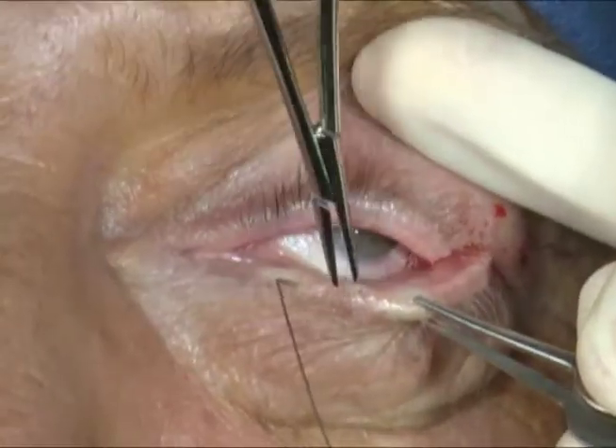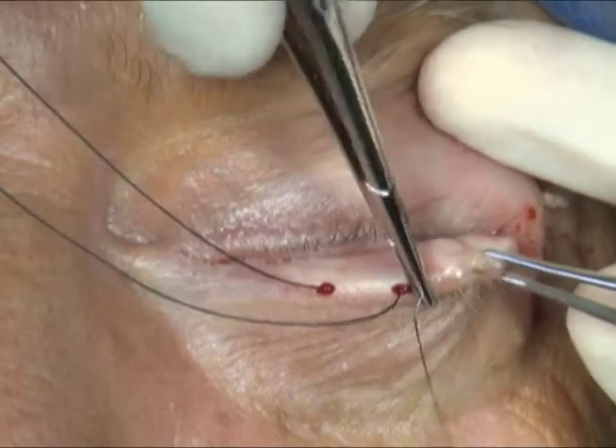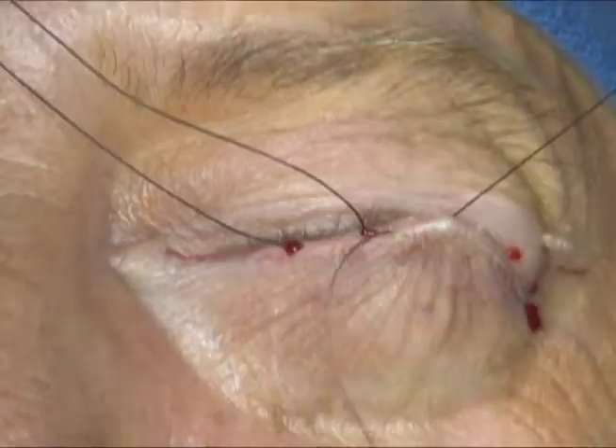4-0 silk sutures are then placed through the eyelid margin at the level of the meibomian glands to provide traction during the case.